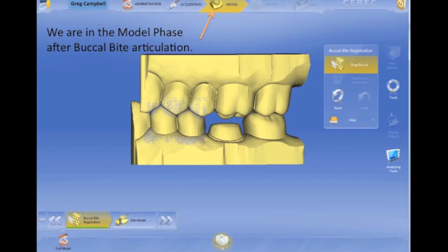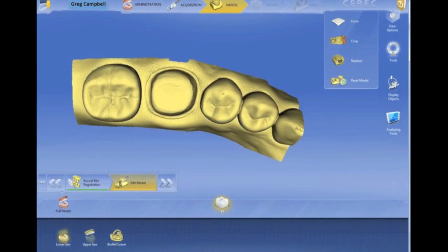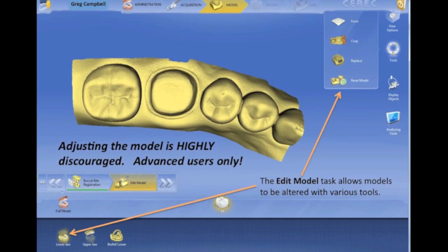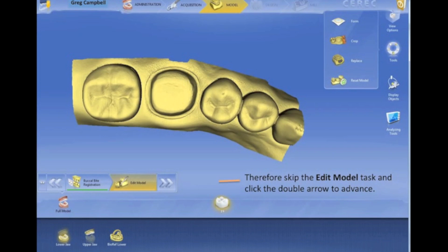Now we're going to our model phase. It shows you right there in your phase bar. Go ahead and click the forward button. Edit modeling is not necessary, and I really want to tell you, stick to advanced users only when doing this — you can really get in a lot of trouble. You can blow part of your model out, or it's not going to be seen fully because you've taken too much material away. But this is a good way to clean up a model if need be, or fix slight imperfections. We'll go over that in a different video later.